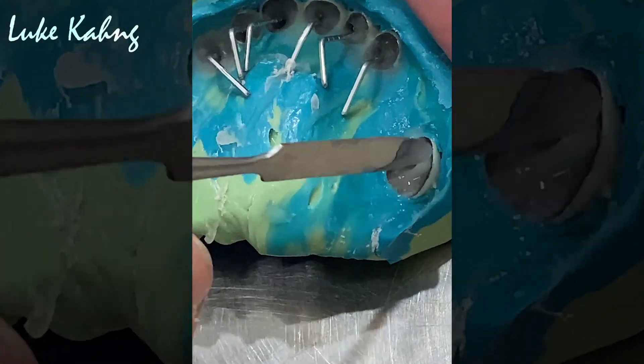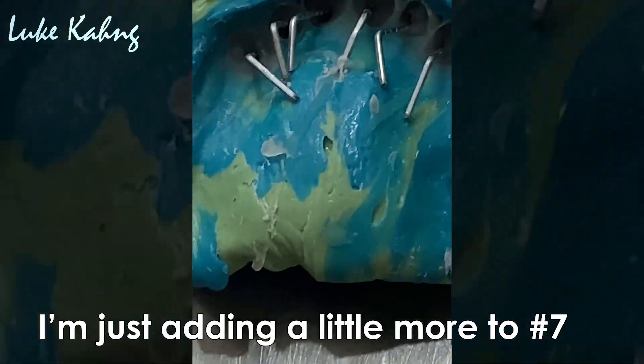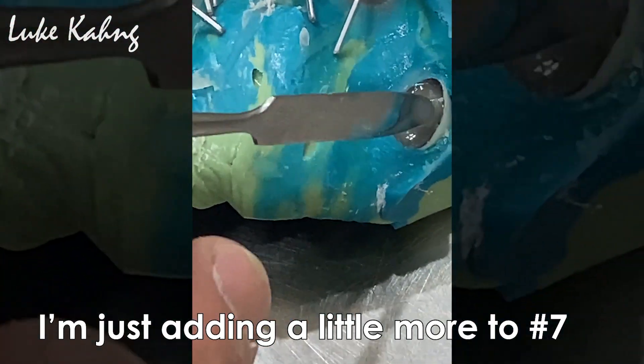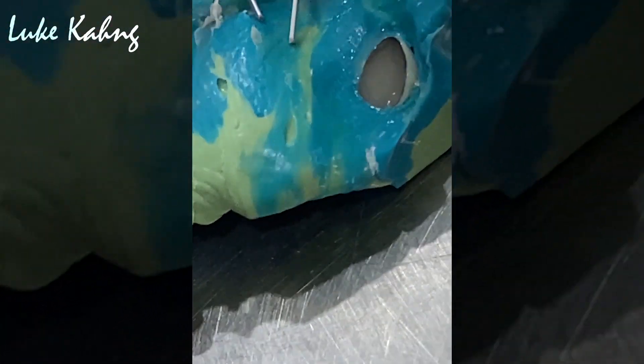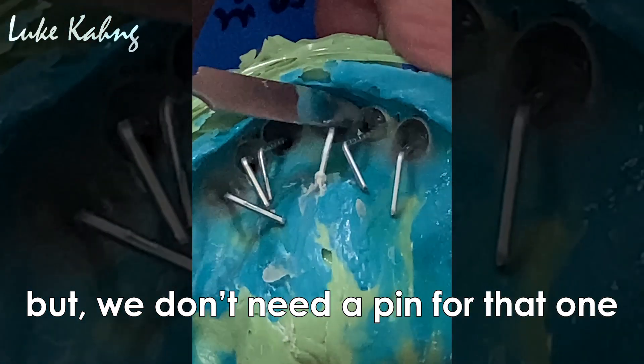In this case we just put it in there, this one on — it's snapping. But we don't need a pin.